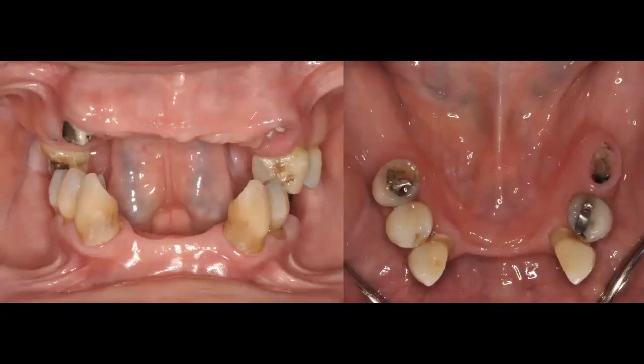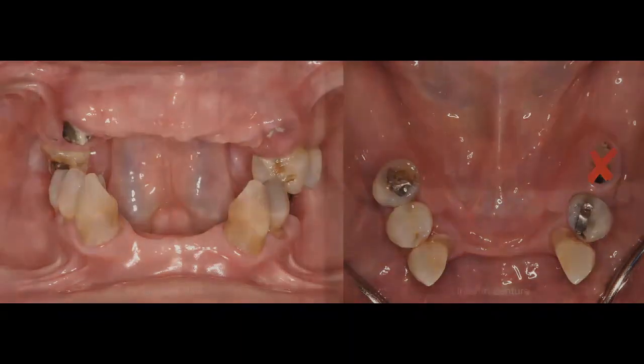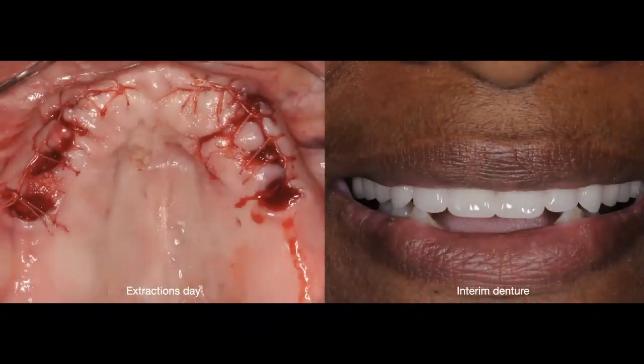We're going to have a complete upper denture opposing a removable partial denture for this patient. On the day of extractions, we want to be as gentle and minimally invasive as possible, avoiding fracturing any bone. You can see that the same day we delivered the interim denture — built upon the patient's actual vertical dimension — making it easier for her to adapt. It's also easier for us to make occlusal adjustments, and the denture has good retention and support for an interim prosthesis.